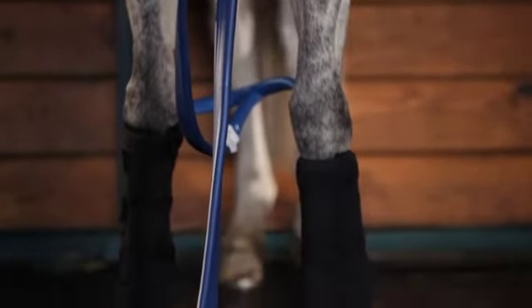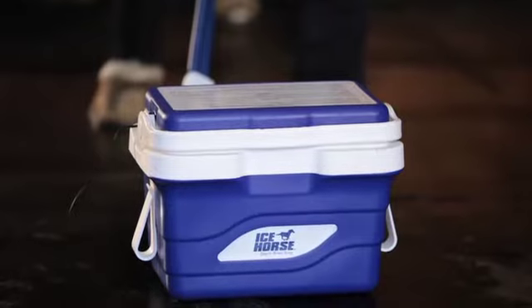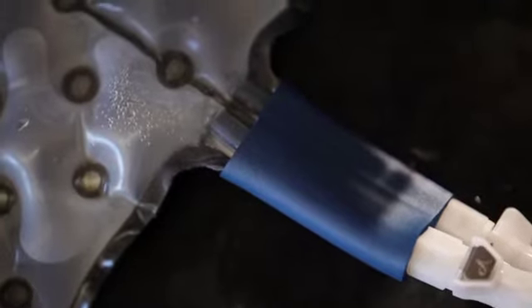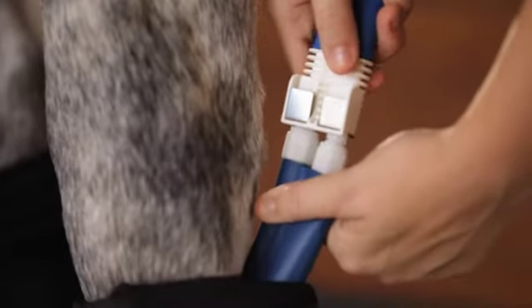Today's Icehorse course teaches you how to use the Icehorse Continuous Compression Water System, the economical system that works to keep your horse's legs in top shape or speed recovery after an injury.